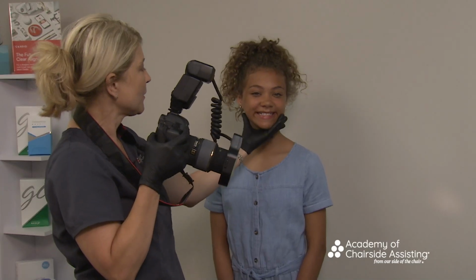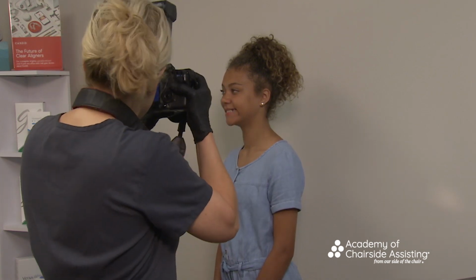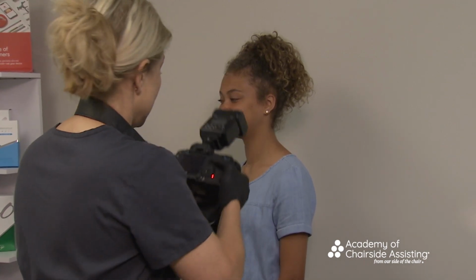So you can see here, I got the lateral right in the center of the frame. So that's the right. Now I'm going to jump to the left. All I'm going to do is keep them right where they are, and I just want them to move. Really important. So this way, I know I'm going to get it dead on. Smile really big. So notice here, I've got a nice right and left. Very similar. That lateral is right in the center.